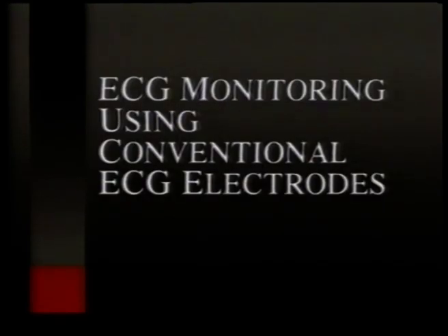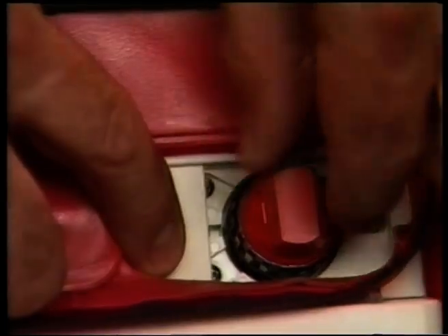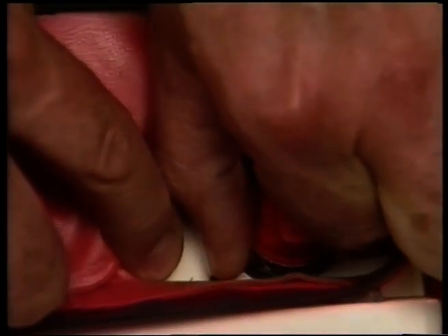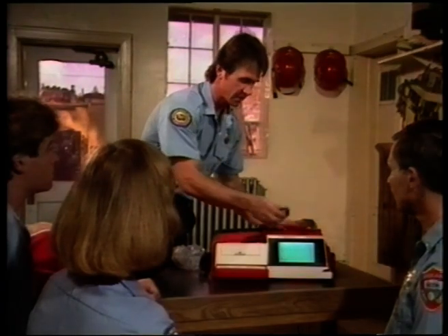The LIFEPAK 300 can display a patient's ECG waveform using conventional ECG monitoring electrodes. Follow authorized medical protocols to identify situations requiring use of these electrodes. To use conventional ECG electrodes, remove the defibrillation cable. Grasp the outer lock collar, twist it counterclockwise approximately 1/4 of a turn, and pull straight up.